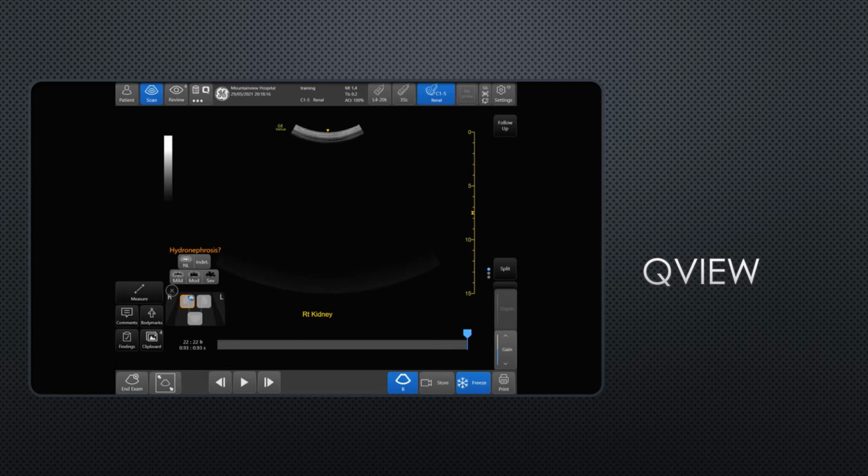So this is going to be just a short video that shows how interpretations can be done directly on the machine as well as submitting for QA. You shouldn't do this if you're on a scan shift or there's another resident scanning, because you can't add them from here, but you want to use full QPath. You can add them so you get credit.